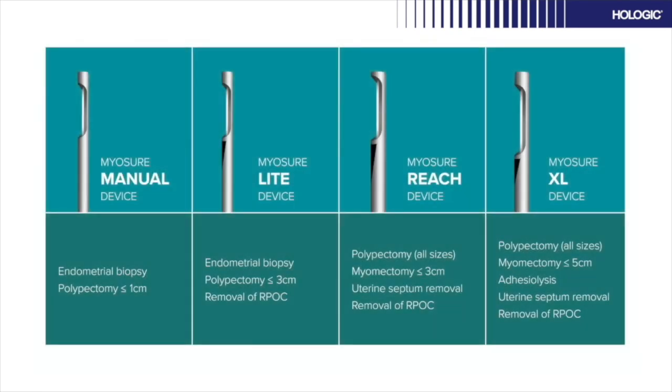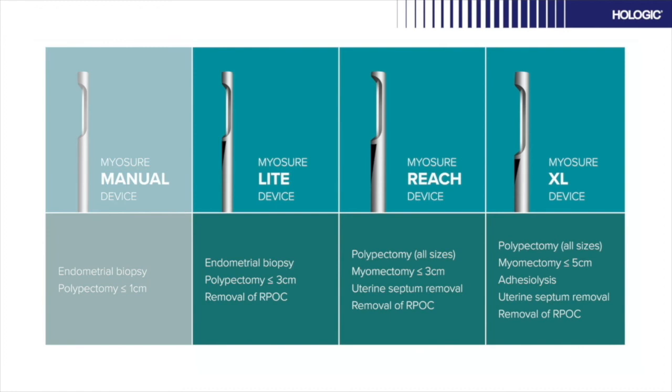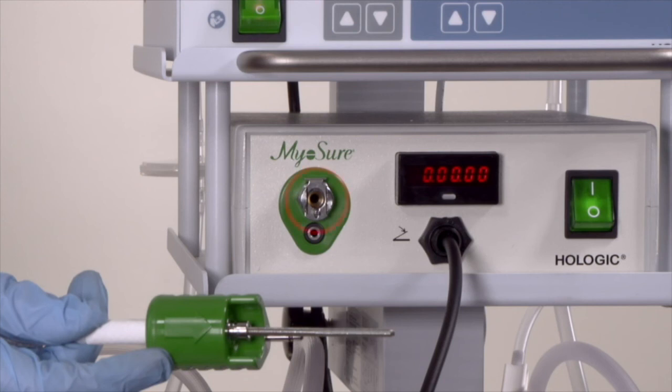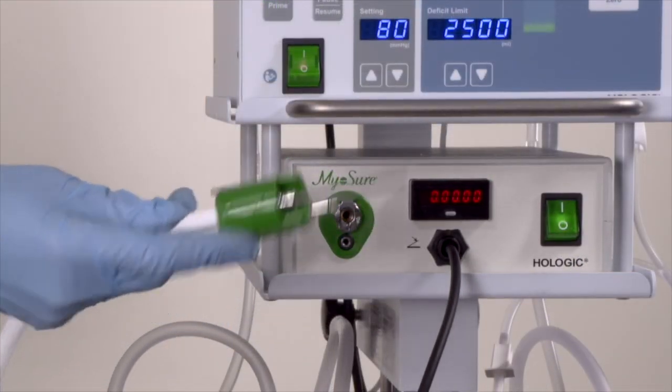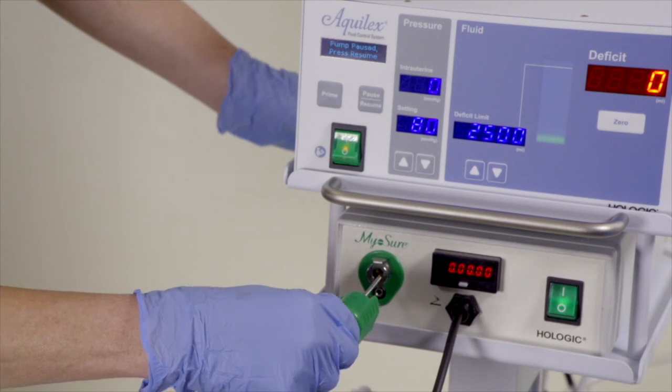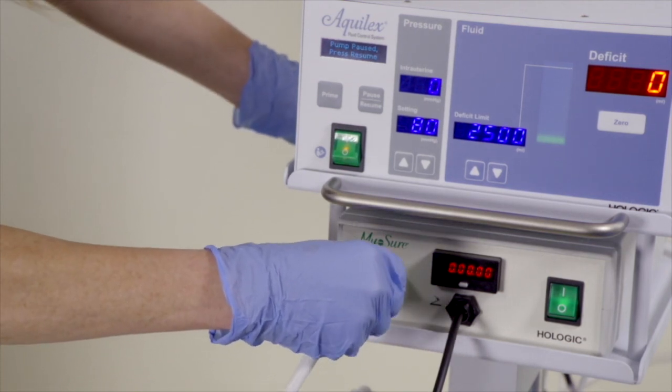If intrauterine pathology has been identified and needs to be removed, ask the clinician which MyoSure device they require. Note the MyoSure manual device does not require use with the Aquilex Fluid Management System or MyoSure controller. Connect the large green end of the white drive cable into the MyoSure controller located below the Aquilex pump. Insert with the arrow facing up, the small pin at the bottom and the large pin at the top. You will hear a click once connected.